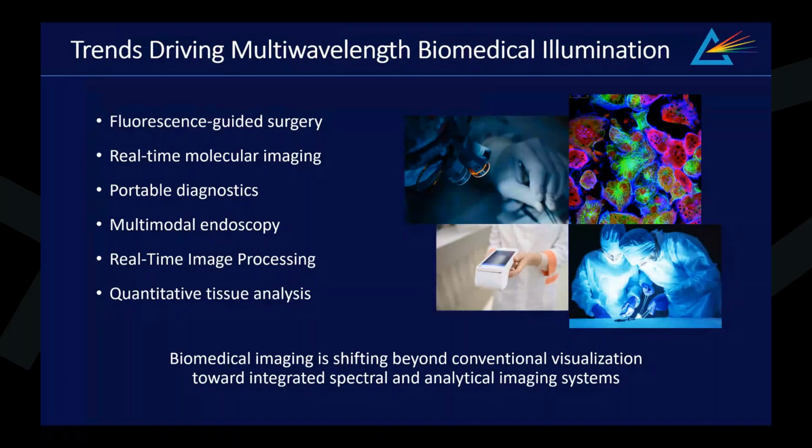Biomedical imaging systems are increasingly moving beyond conventional white light visualization toward multimodal and spectrally driven imaging approaches. One of the major trends in biomedical imaging is the transition from conventional illumination systems designed primarily for visualization toward imaging platforms that support both visualization and analytical imaging simultaneously.